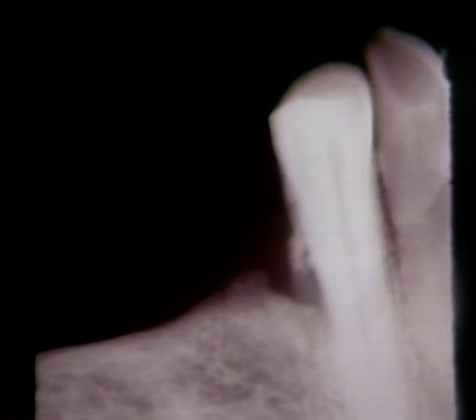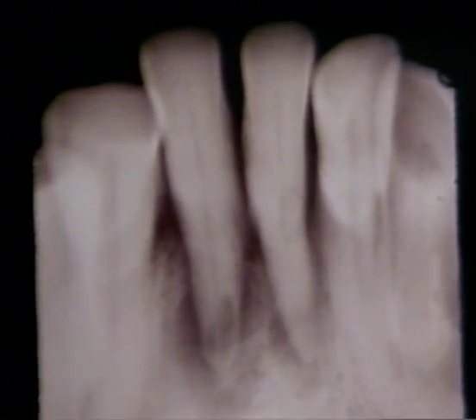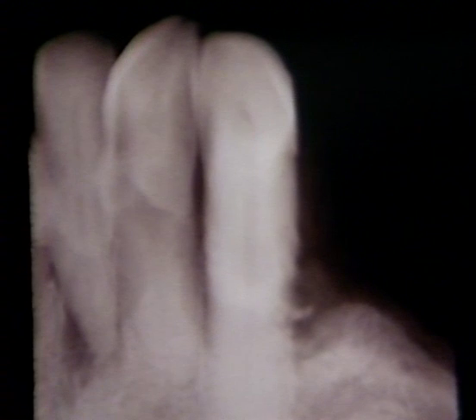Preoperative radiographs show resorption of the alveolar process around the remaining 6 mandibular teeth. Bone loss on the central incisors extends to the apices, and periapical lesions are present.